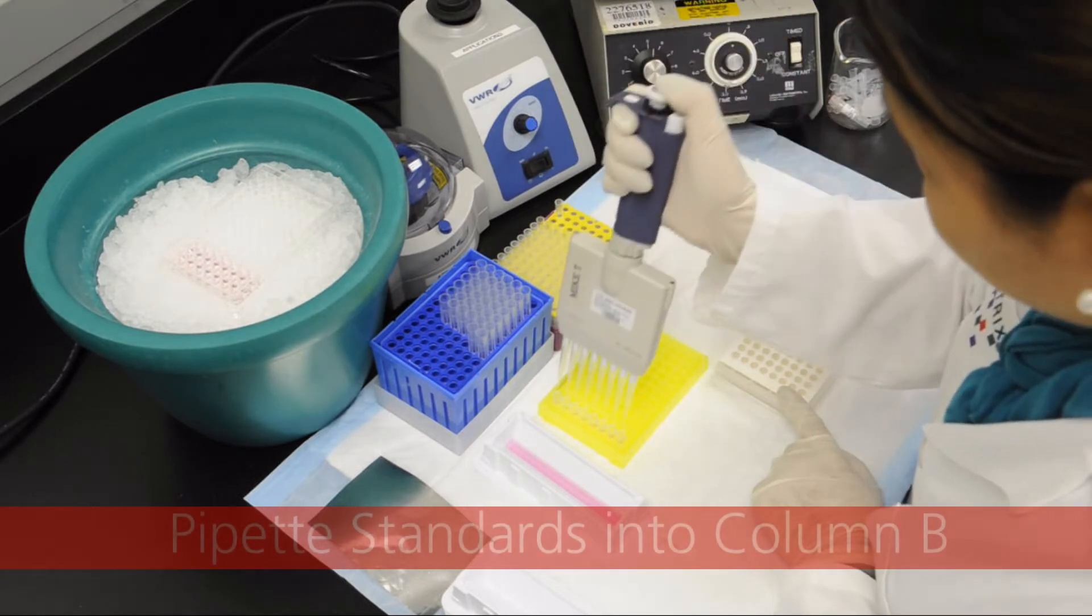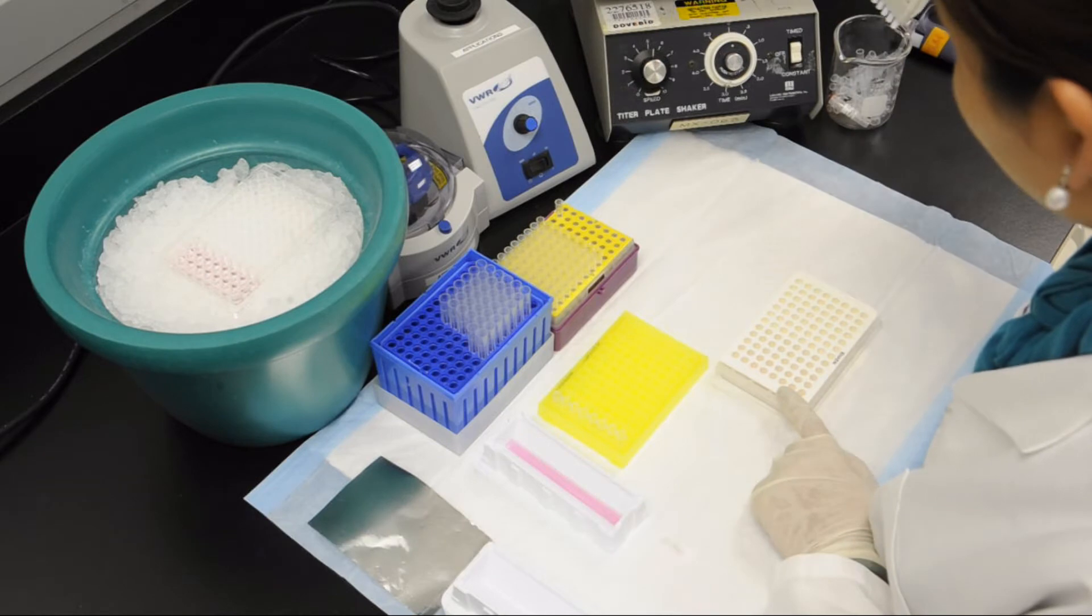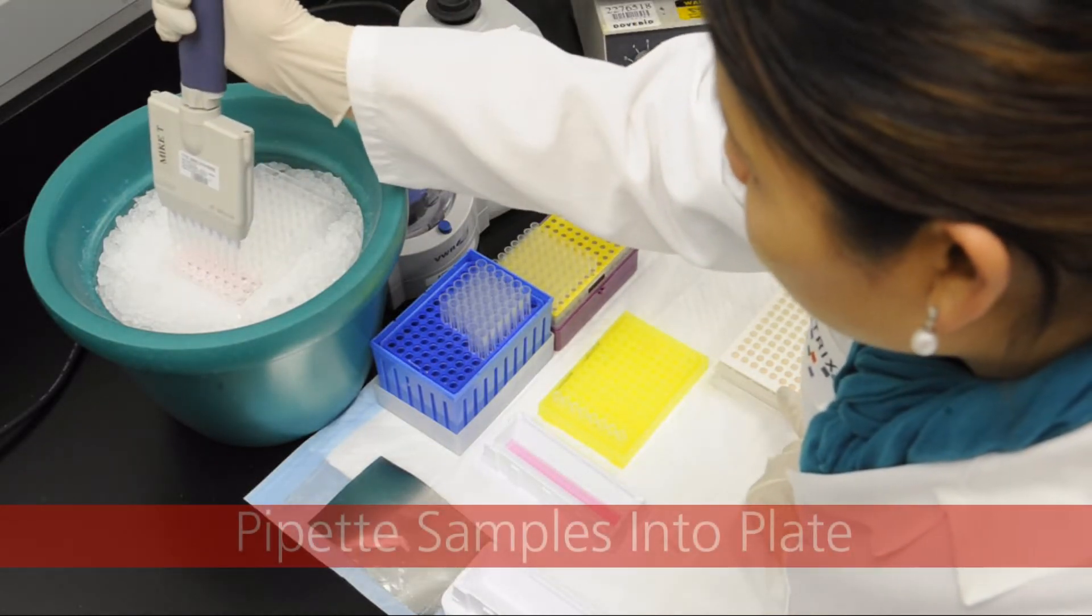Using new tips, transfer 50 microliters of the standards into column B of the microtiter plate. Using new tips, pipet the samples into the plate.